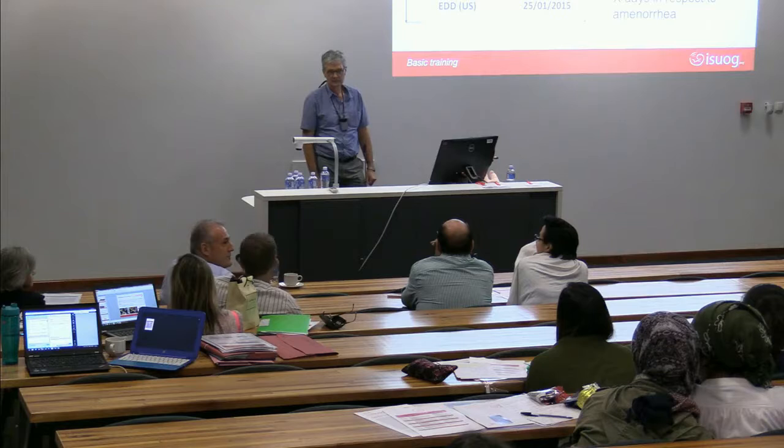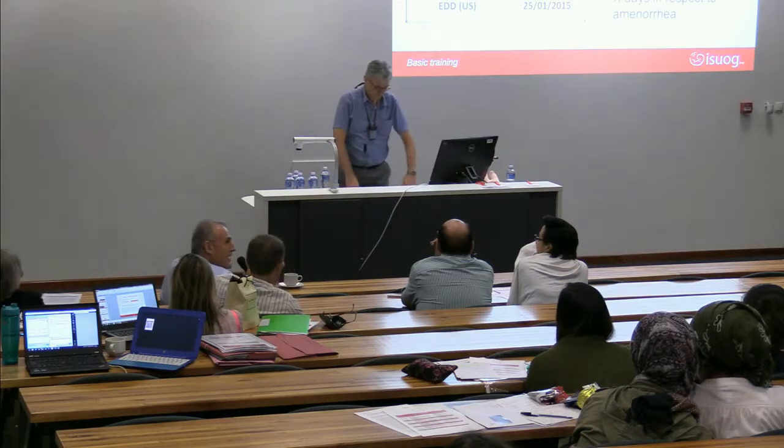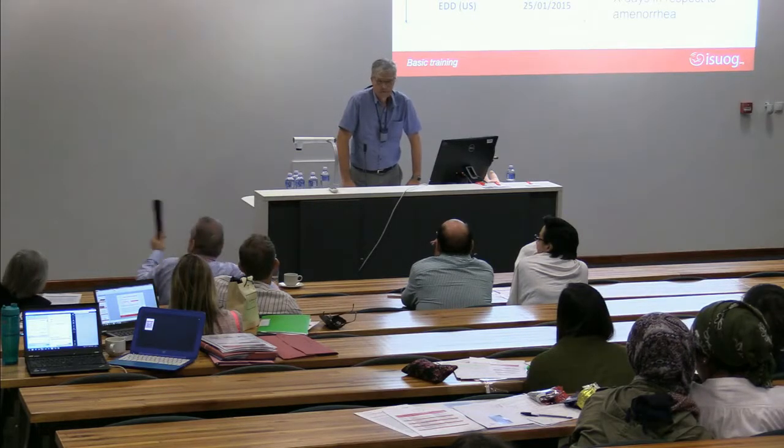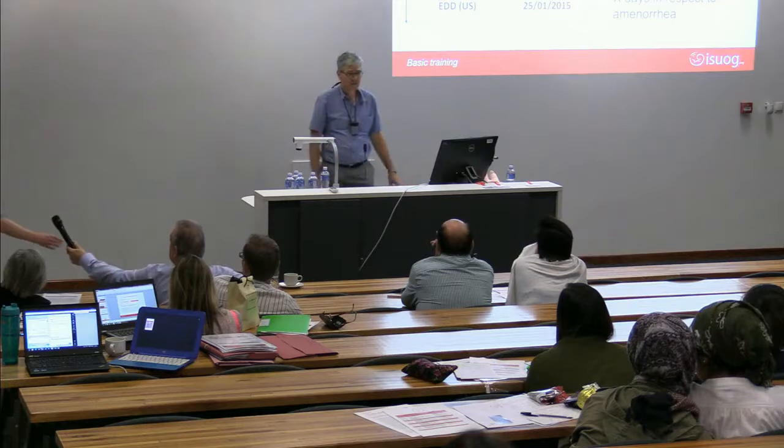Yeah, and I think it's important to know what formula is being used in your machine to be able to establish exactly the gestational age. Thank you for that, and I think that's a really valid point. And go back home, check your ultrasound, and if it's got any other crown rump formula except for Robinson, just delete it. Don't make a backup, just delete it.